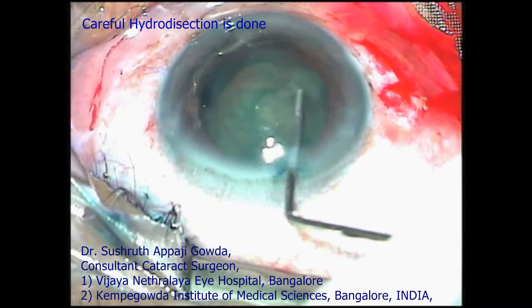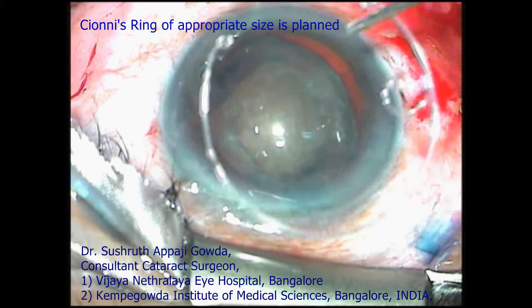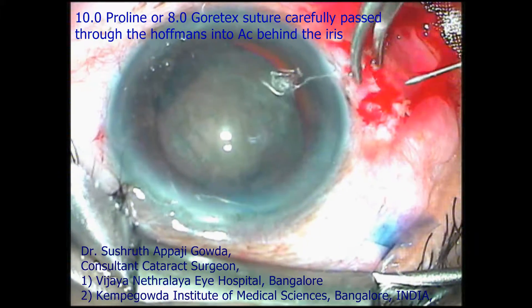Once the rhexis is complete, we can prepare inserting the Cionni ring after careful hydrodissection. A 10-0 prolene suture straight needle is passed through the Hoffman's pocket behind the iris and made to appear in front of the lens-bag complex by careful indentation of the lens and correct orientation of the needle.